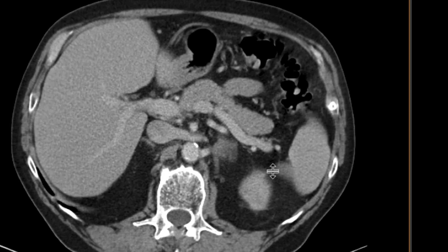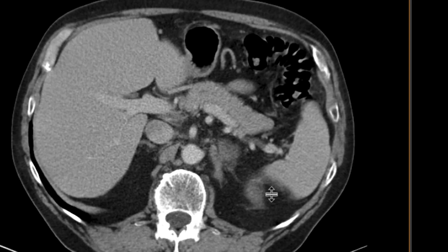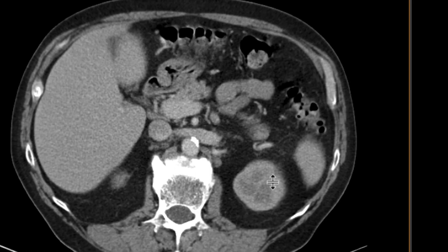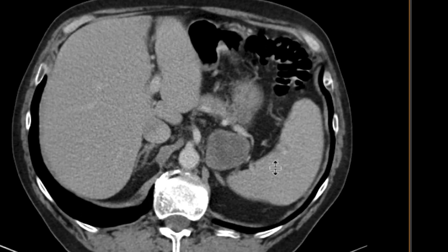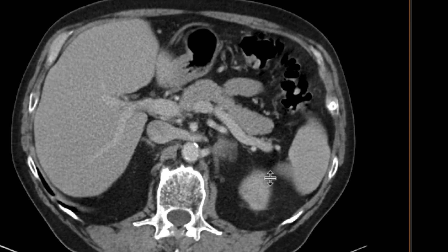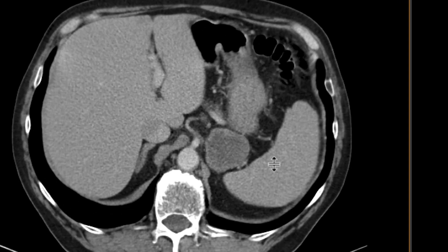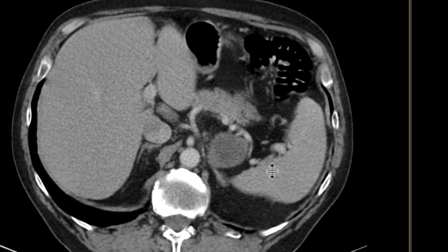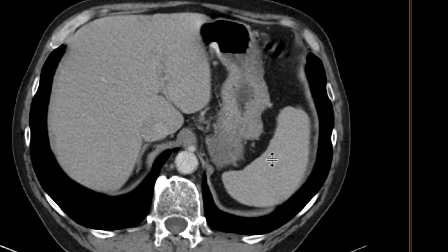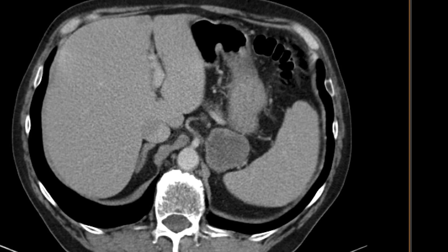The mass is really quite close and intimately associated with the left adrenal gland. Portions of the left adrenal gland also look nodular, independent from this lesion. When this was initially reviewed, it was thought to be a mass arising from the left adrenal gland, and given its heterogeneity and size, adrenocortical carcinoma was favored at initial glance.